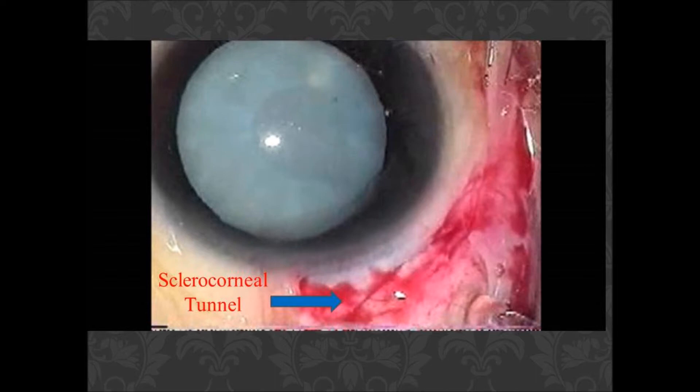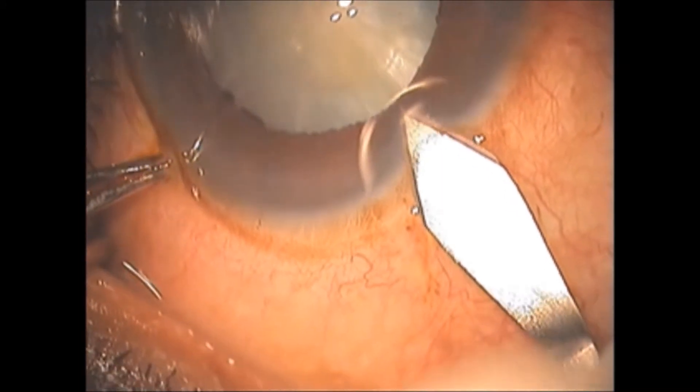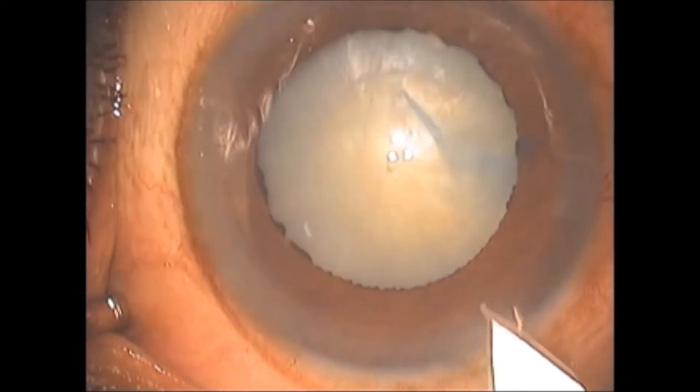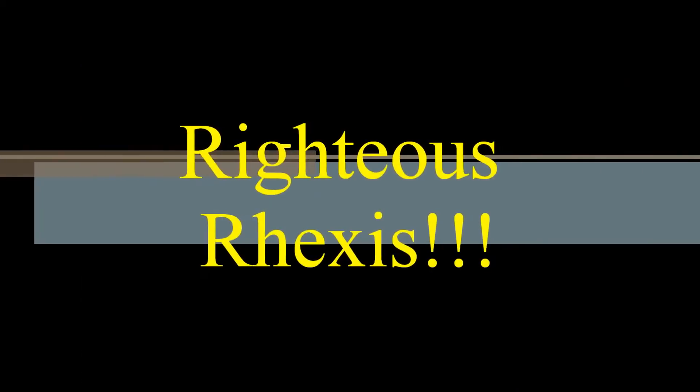Two incision types can be used. The first is the sclerocorneal tunnel incision — wound integrity is better and conversion in case of a mishap is much easier. The other is a direct entry with a 2.2 or 2.8 keratome, which is done by most senior surgeons.